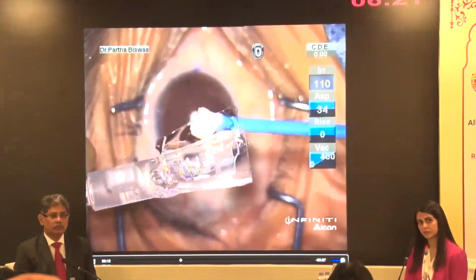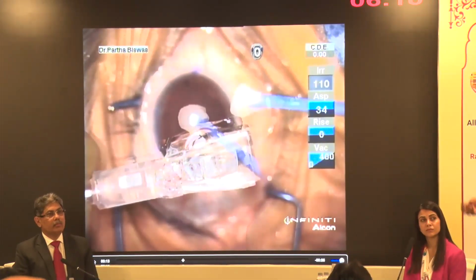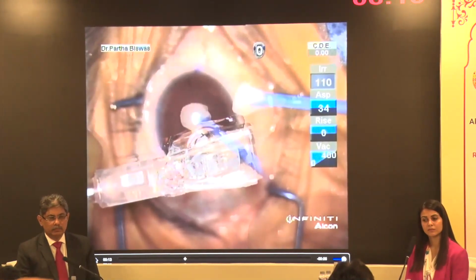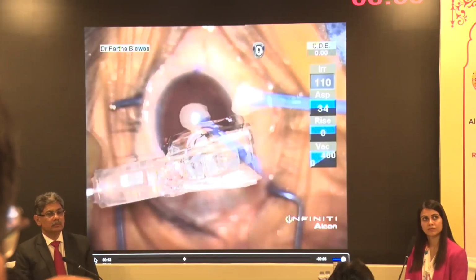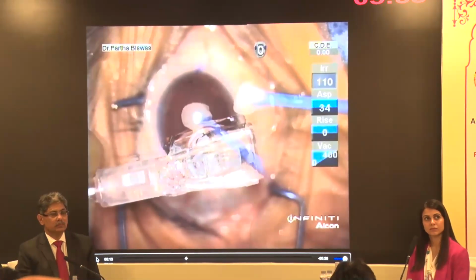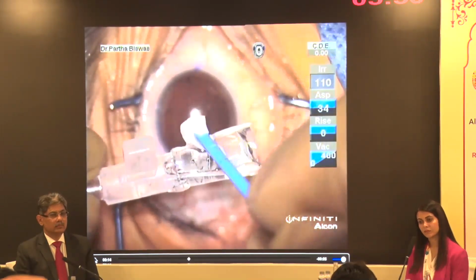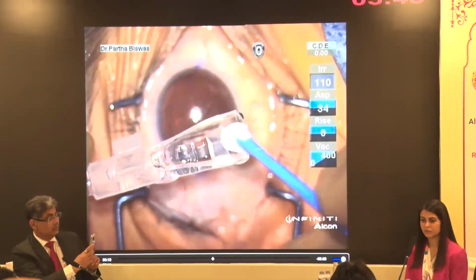Please do it carefully. They don't give the ICL in twos. With the IPCL and other lenses, you have a second one in case it drops. So you must use it either on the trolley or on the field of view over the patient, wherever, so that if it falls you are able to pick it up. It usually will not fall unless again it becomes dehydrated, with too much manipulation in the atmosphere. Once you take it in, you place it in the hub just like that, and then you know which is the right side up, convexity 100% up, and you have to tweeze it in.